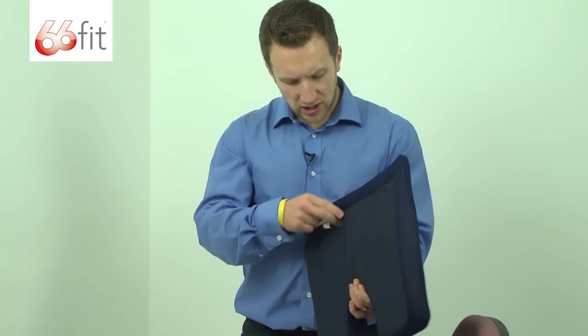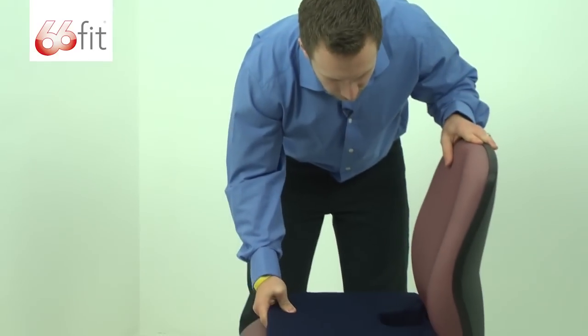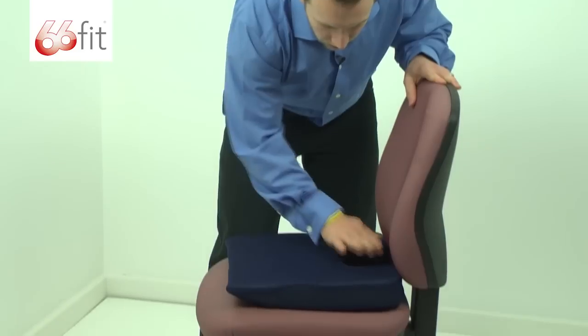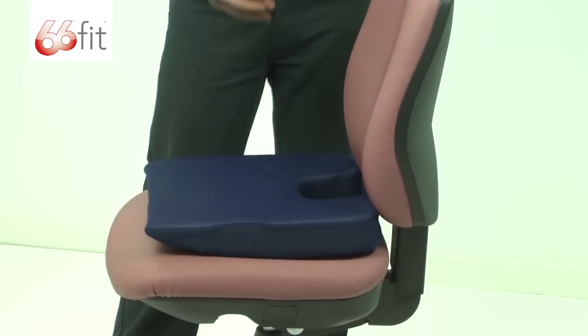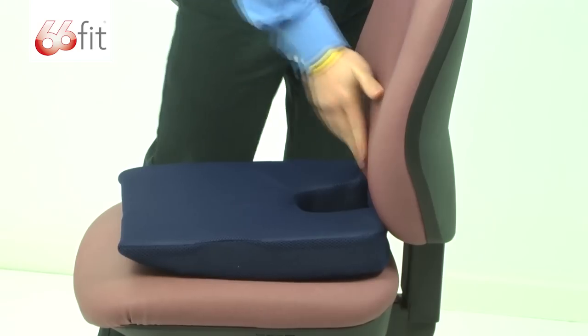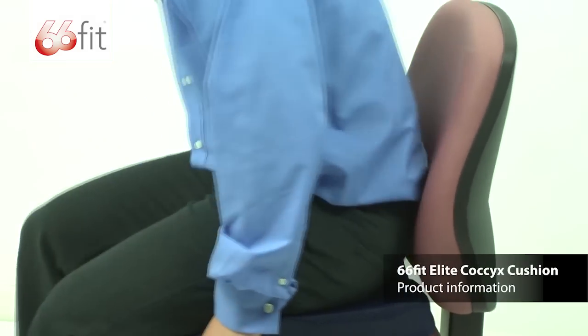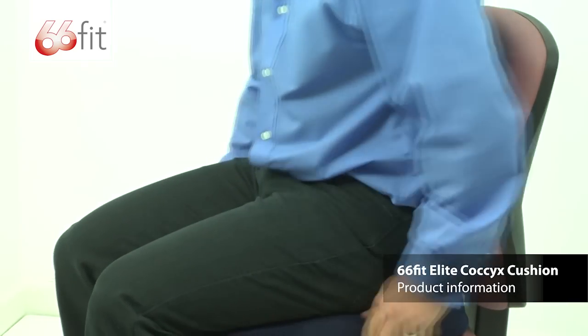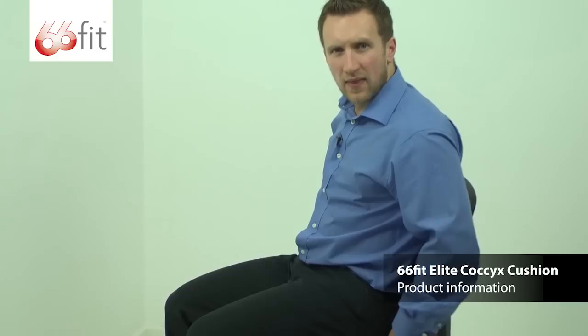Now, when you actually sit on the cushion, make sure that you put it towards the back of the chair and then put your coccyx right in the centre of that hole. It's going to sit you up nice and upright — make sure that you sit all the way to the back of the chair and take the stress and strain off of the area that's been injured. Just going to sit down on it — sits you up nice and upright, and that area that has been affected will have all the pressure relieved off of it. Thank you.